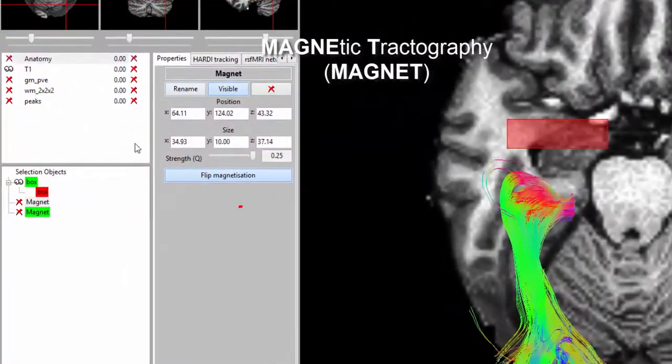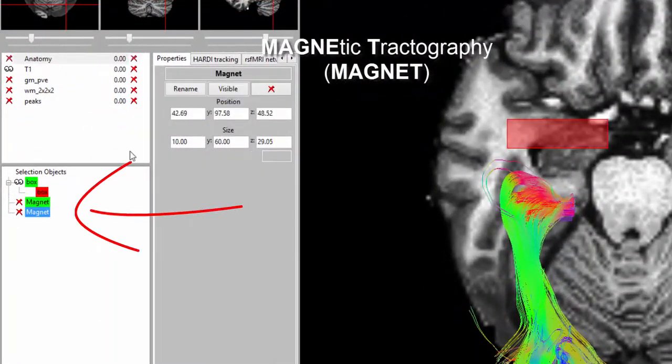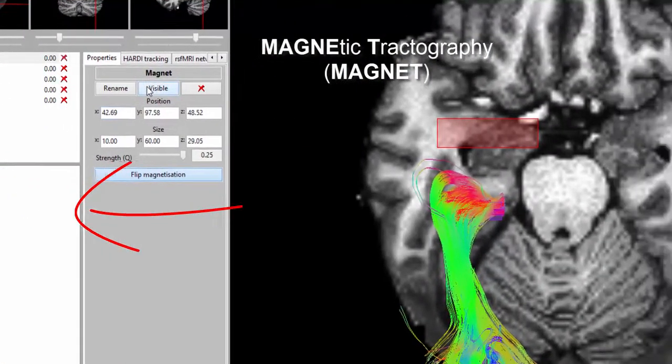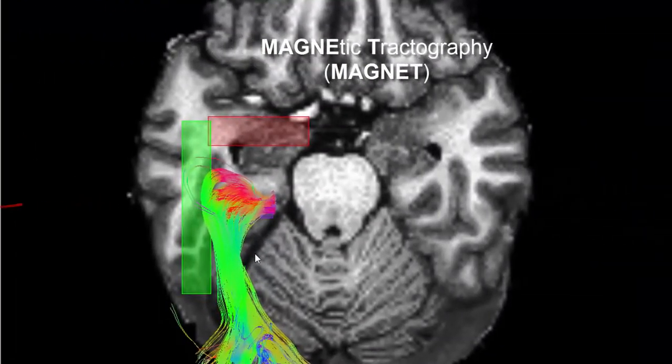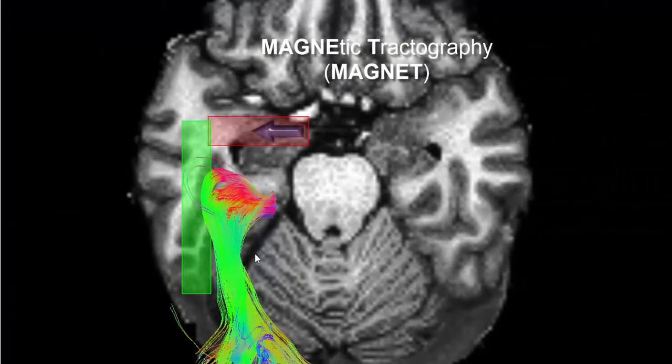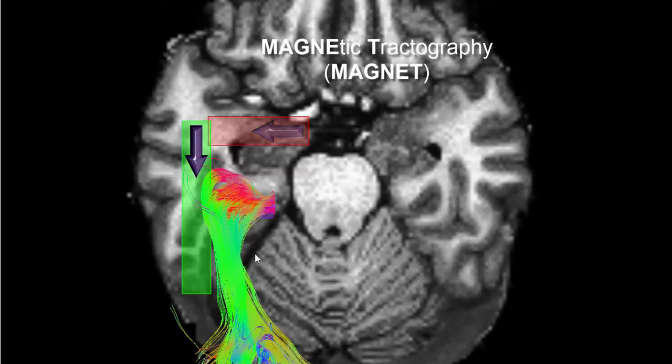Here, we propose the use of oriented ROIs, which dictates which directions to follow, if supported by the underlying diffusion data. We term the method magnetic tractography, or MAGNET.